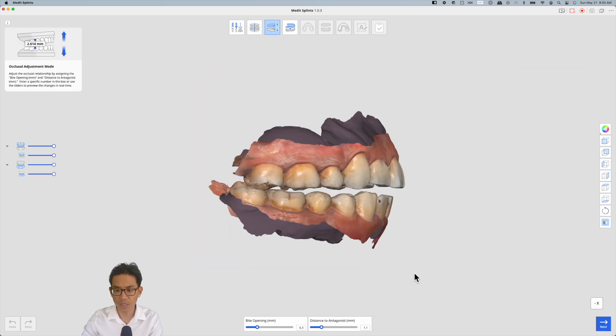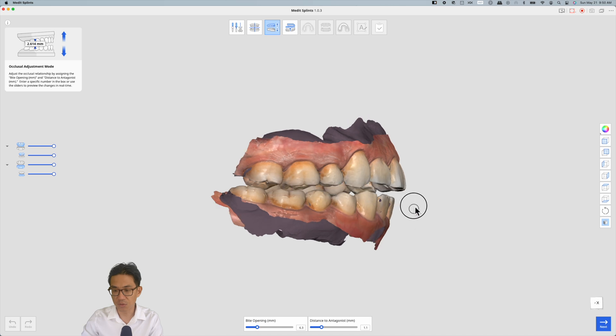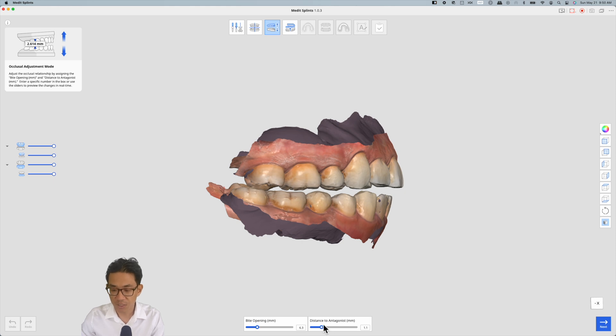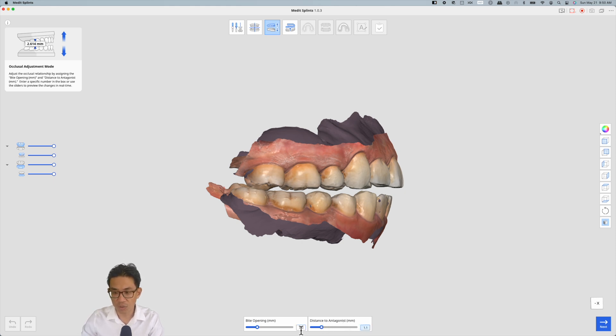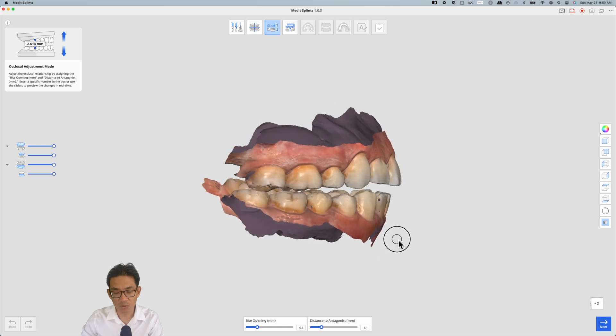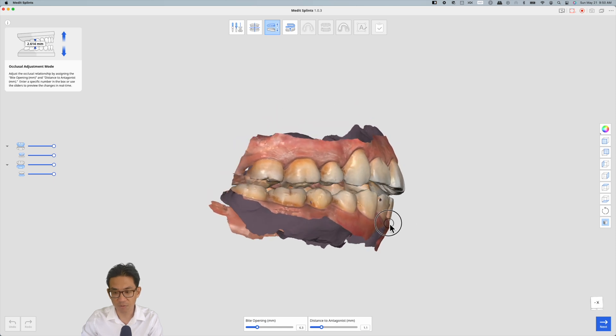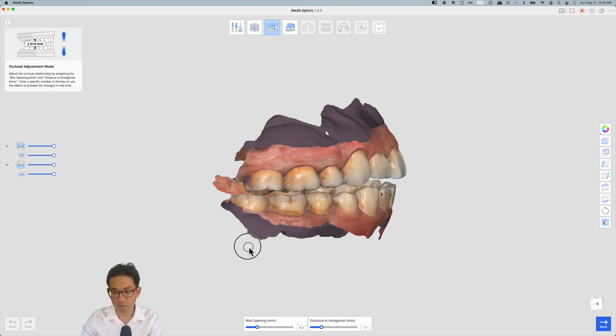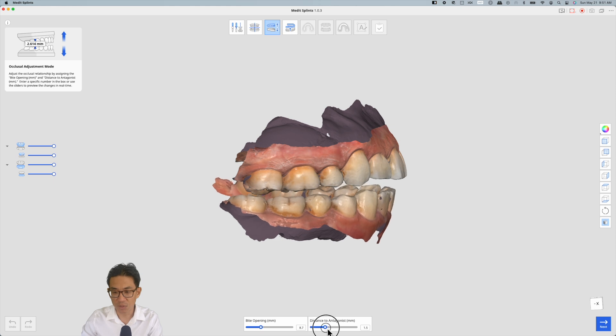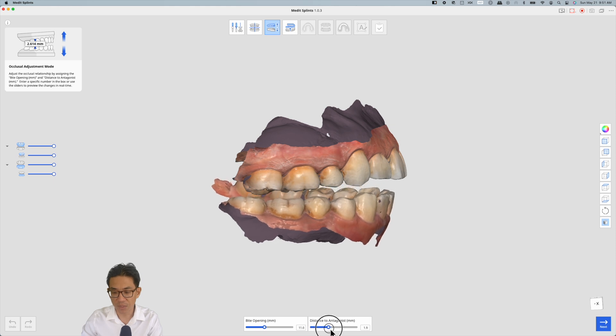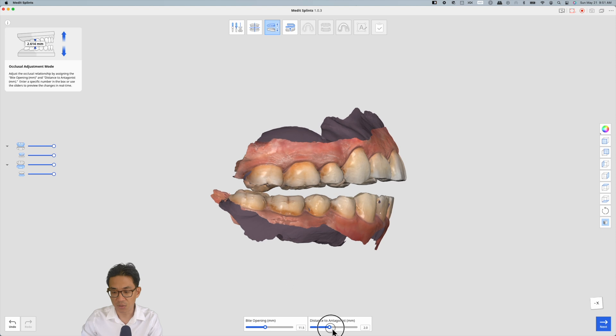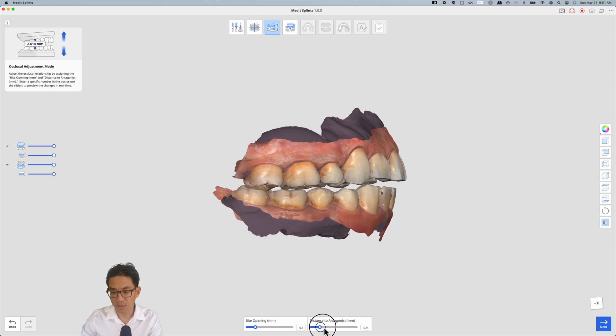Next. This allows you to choose the space in between the night guard. As of this video right now, we like to set it at 1.1mm. This is what we're using for our patients. We don't seem to have any fractures. However, if you do need to increase the thickness of your splint, then you can slide this back and forth.